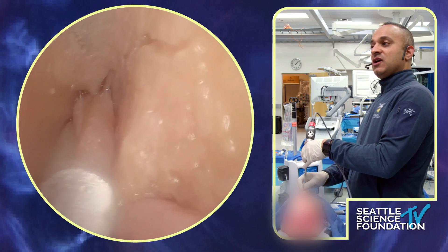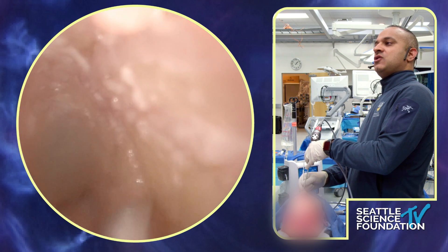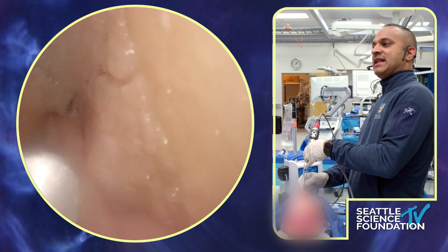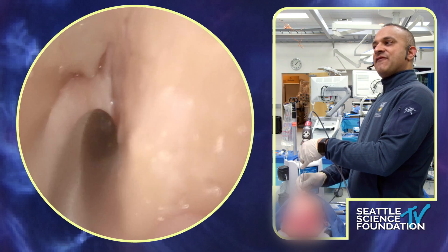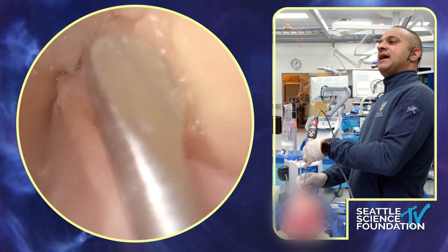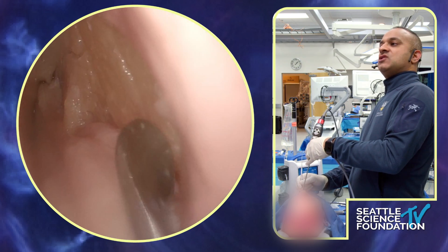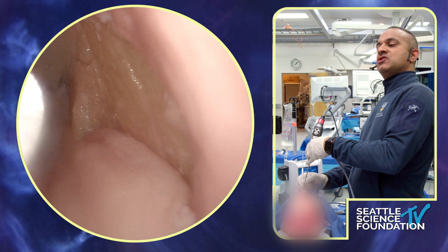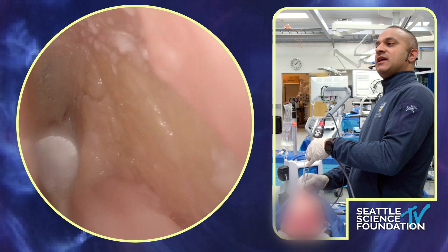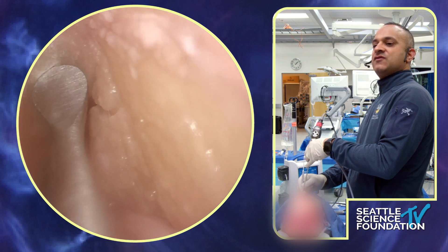We're looking for a landmark here. Usually there is a little dorsal artery and nerve about halfway back that can confuse you into thinking you're going to find that first olfactory neuron. But in fact that first olfactory neuron looks like this — it comes with an artery and a nerve together — and that is exactly the posterior limit of our dissection. You did all of this to identify the bone that needs to be drilled out to get access to the floor of the frontal sinus, which you can see is see-through. If I put myself through here we'd end up in the frontal sinus floor.